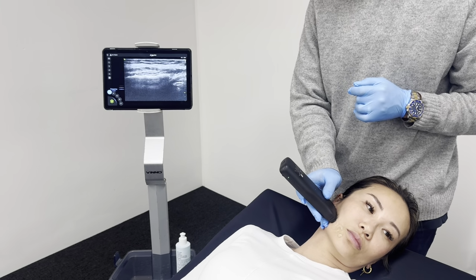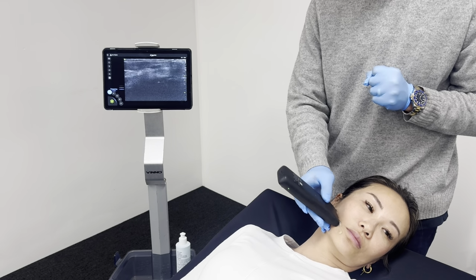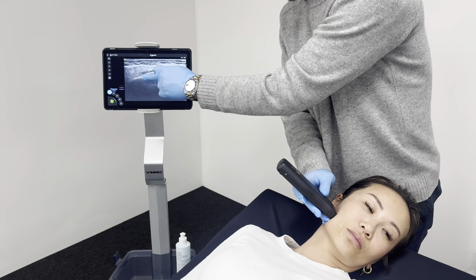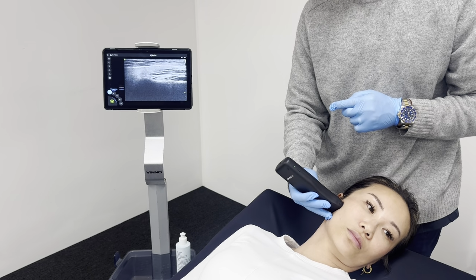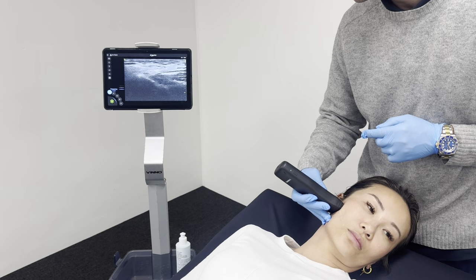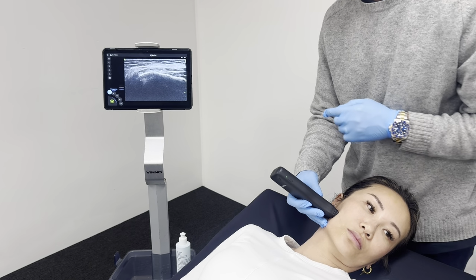So can you do a few jaw clenches so we can see that masseter muscle bulging? We can see it bulging there. Perfect, and relax. And if we come right up towards the ear, we can usually find the parotid gland, which usually has a fairly homogeneous speckly appearance, and we can look for a lymph node within that parotid gland as well. It's usually a dark kidney bean shaped structure. Let's have a look around and see if we can find that within that parotid tissue. I can't see that very clearly.